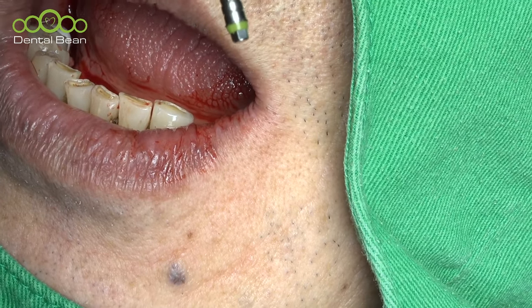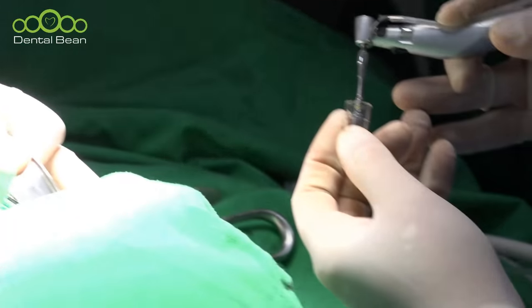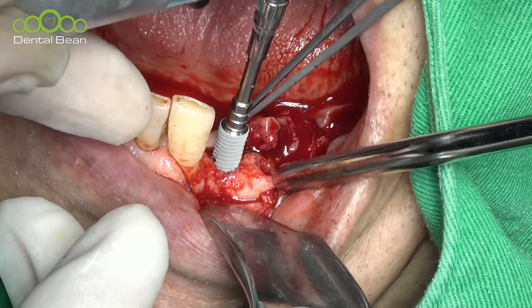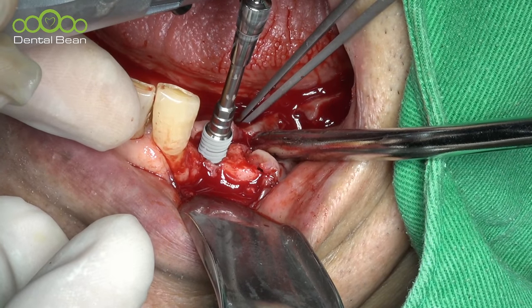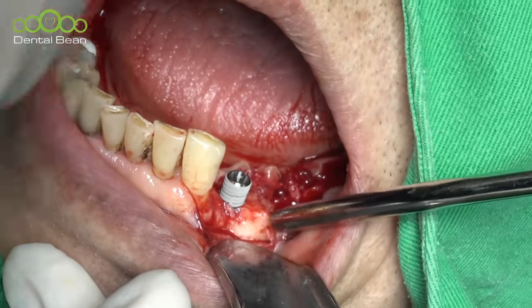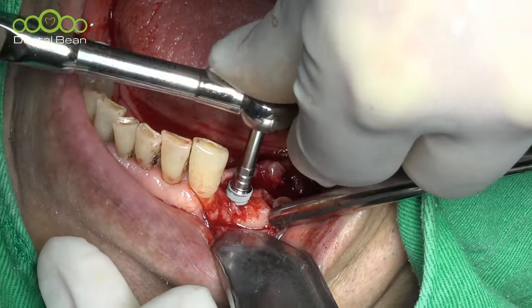Good patient. 4, 10, 20, 30, 40. A little high. A little high initial. The self-threading power is very good.